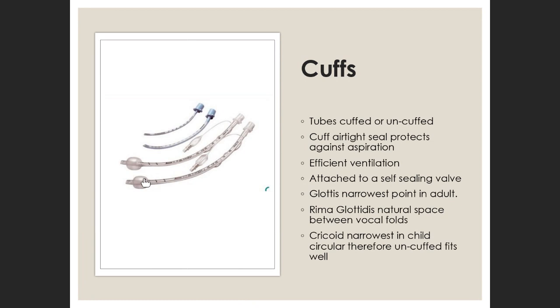The purpose of the cuff is to allow us to put air through this. This is a tubing, and this is what we call a pilot balloon. A pilot balloon essentially is a balloon that simulates what state the cuff is in. If the cuff is down, the pilot balloon is flat. If the cuff is up, then it's also distended.